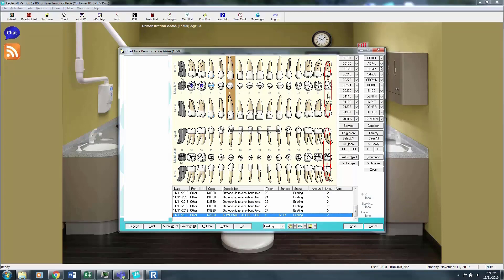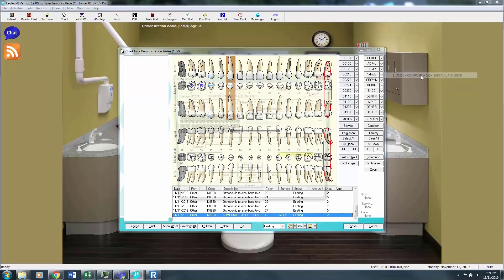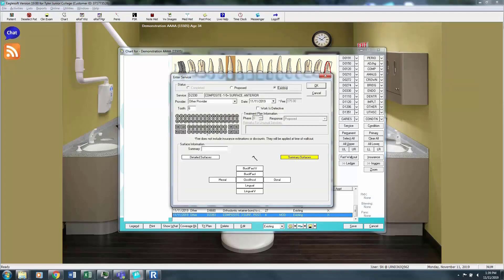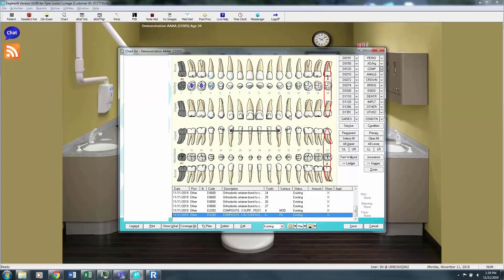Tooth number 6 will put a class 5 composite. Now this one is now an anterior tooth. Buccal class 5 existing.